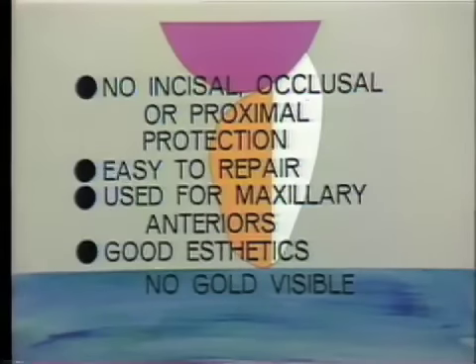One point to remember about them is that you get no incisal, occlusal or proximal protection, and so cases need to be selected carefully in which this is not a primary requirement. They are easy to repair should they fracture at any time by merely selecting another facing of the correct mold and shade, making any necessary proximal and cervical adaptations to it, and then re-cementing it back in position without taking the bridge out of the mouth.